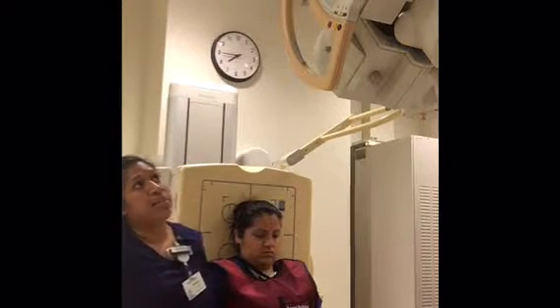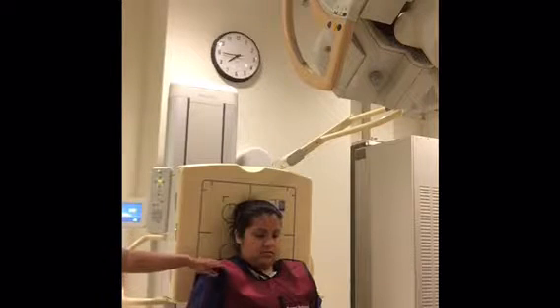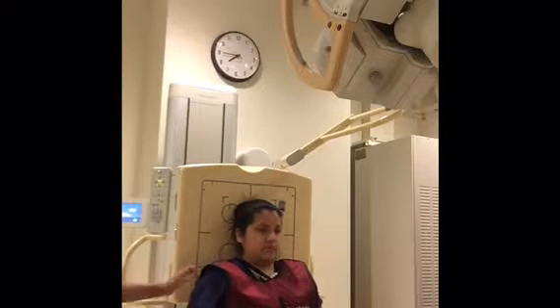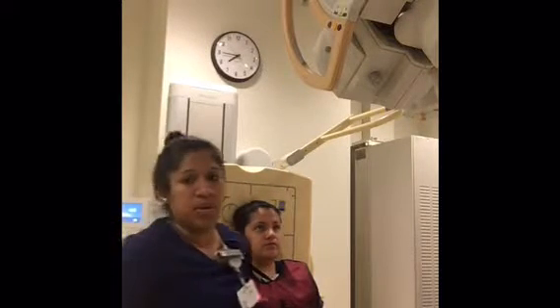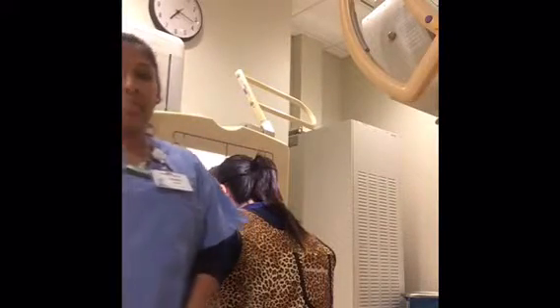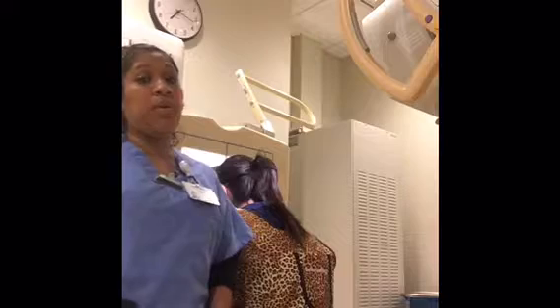So now we're going to ask the patient not to move, so please hold your breath. Okay, beep. Okay, and now you can breathe and relax. Okay, perfect. And now we're going to move on to our next image. Okay, now we're going to do our next projection, which is the PA axial Caldwell method.